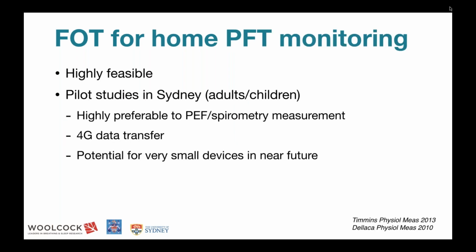So we've looked at using forced oscillation in the home, and it is a highly feasible thing for patients to do at home. Even the elderly patients with COPD that we've studied, and studies like that are ongoing, actually do the test really well at home, and looking at the quality control, it's excellent in most of them.